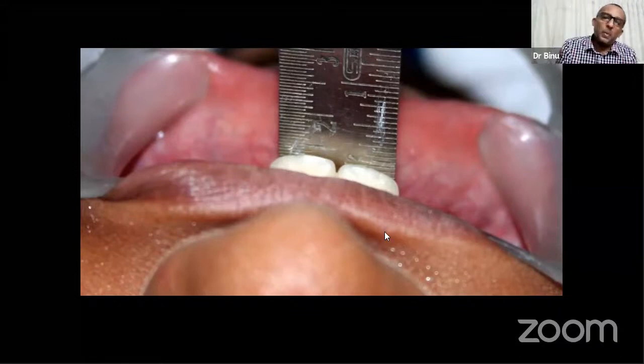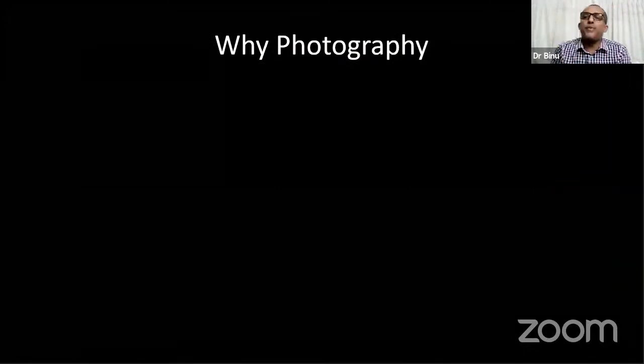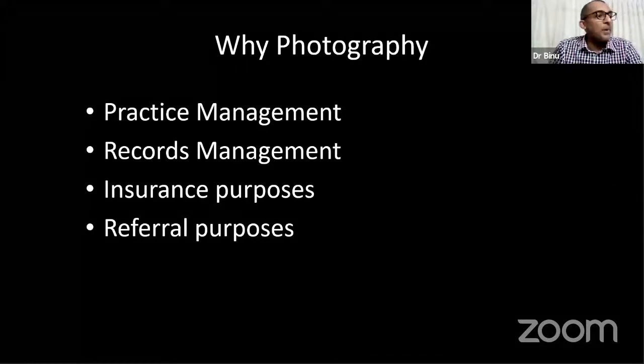So, we are on the topic of convincing patients using photographs. Why do you need photographs in a dental clinic? I already covered the topic, practice management. In India, the answer is one: practice management. But anywhere else in the world, the answers are different. It can be records management, insurance purposes, referral purposes.